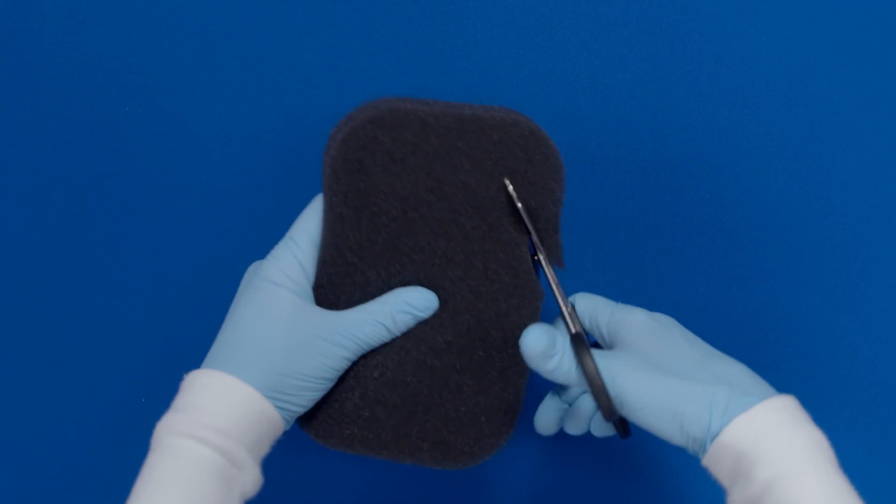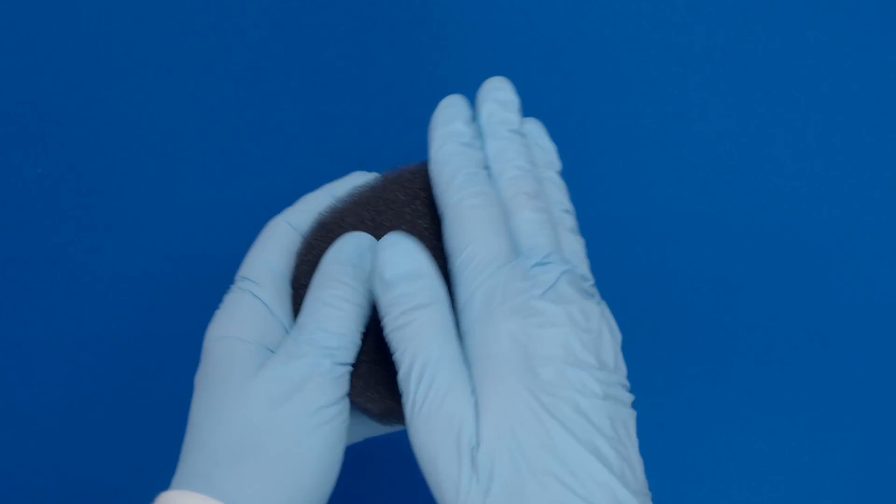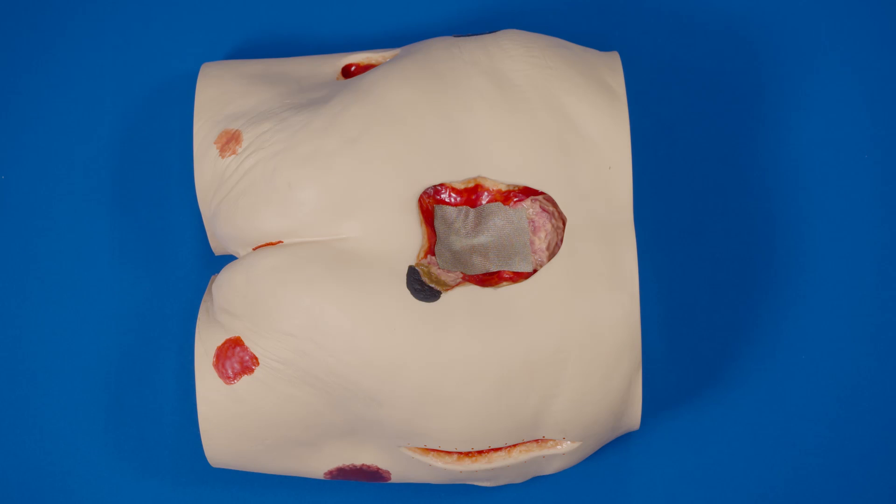Cut the foam to fit the size and shape of the wound. Do not cut directly over the wound. Rub the edges of the foam to remove any loose particles.